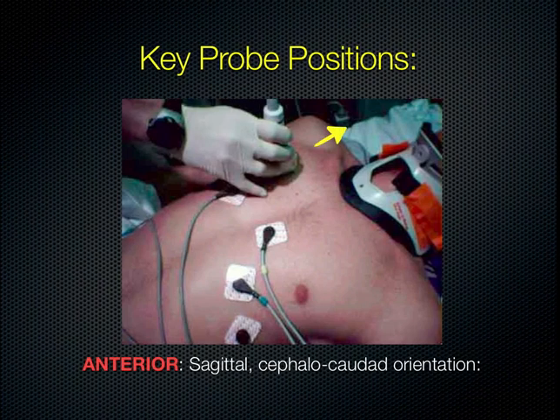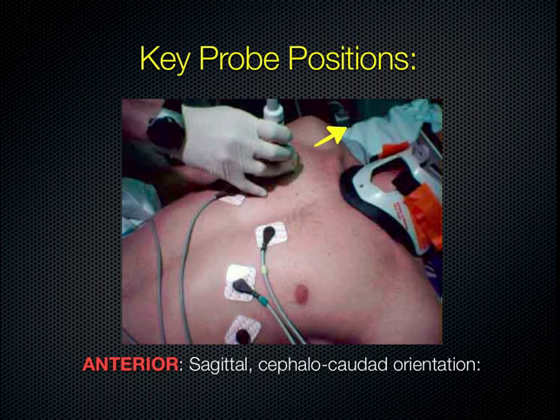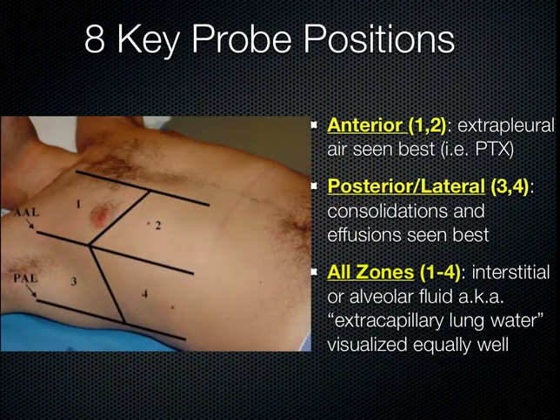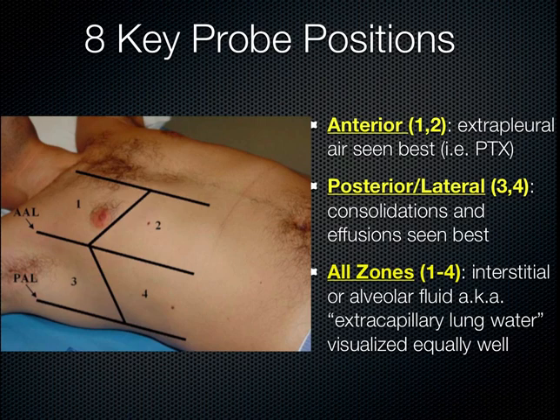There are several key probe positions. The indicator for evaluation of the anterior chest should go towards the head — this is the orientation marker. Anteriorly, we look at the sagittal orientation, the cephalocaudate orientation intersecting two ribs and the pleural line beneath. Laterally, with the probe indicator again towards the head, we achieve a coronal picture.